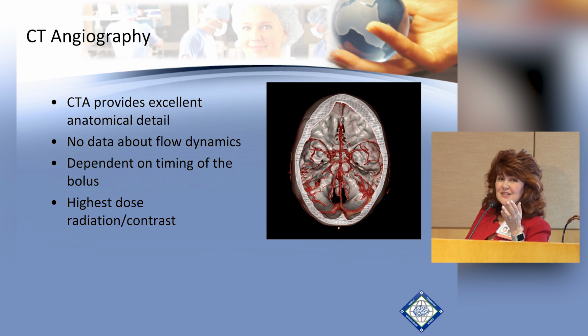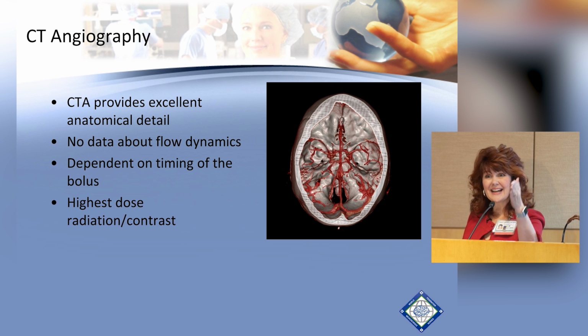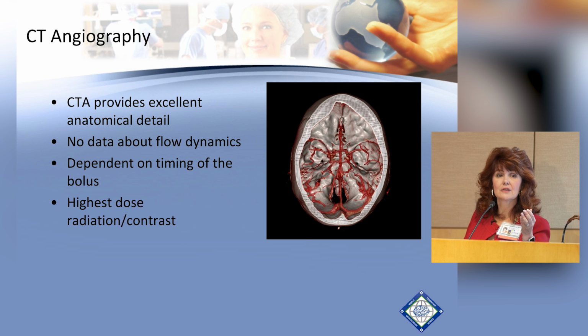And it's the highest dose of radiation. So if you think about, oh, we'll just get a CTA, and then tomorrow we'll get a CTA, and the next day we're going to get a CTA, that's a little bit worrisome because you do have that high dose of radiation every single day. So we very carefully dose out who we're going to give a CTA for, because if we do them daily, we end up with a very, very high dose of radiation over time.